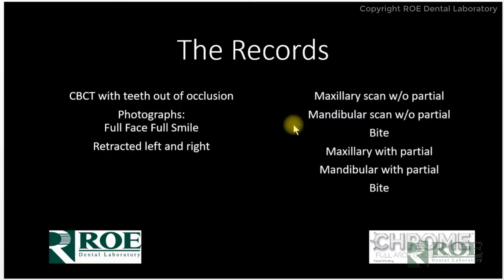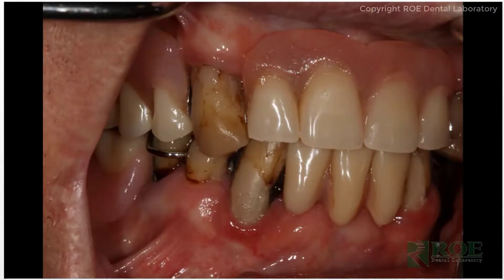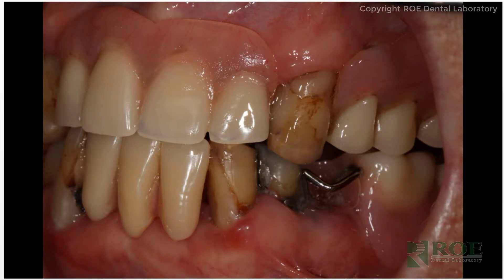Those are the records. Here are the photographs. What we want to see is retracted, straight on — and you can see this is a very nice photograph from Dr. Quittmeyer. You can see a nice full depth of view, full field, which is good for us for articulating the cases because we will pull these images up on screen and match them with the articulated cast we have in front. So those are three photos: left, right, and center, in occlusion, retracted.